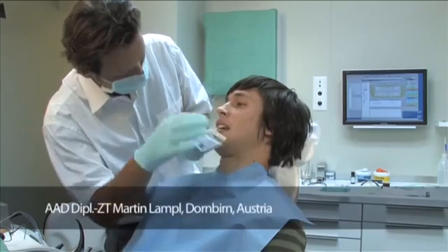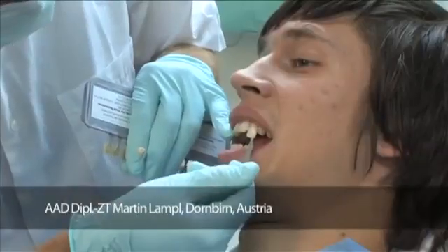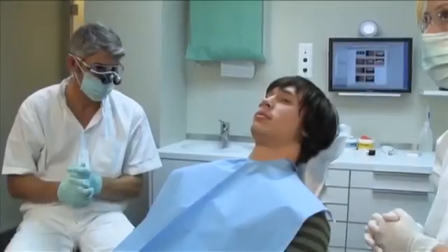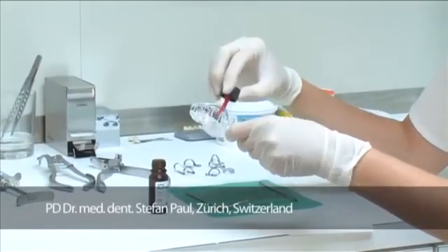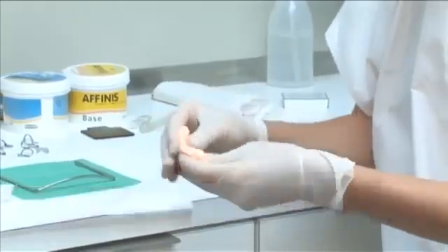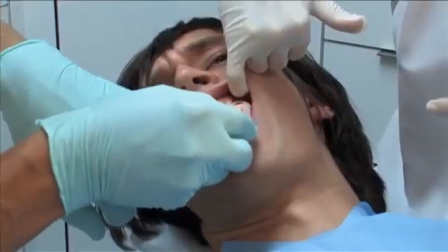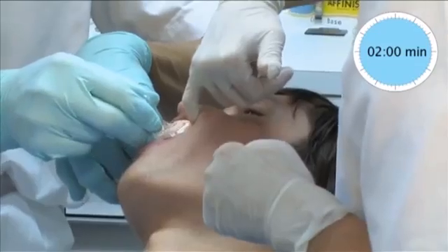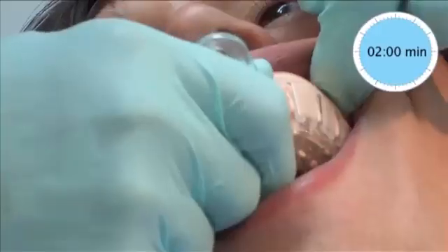The shade selection is performed at the beginning of the case by the dental technician using a standardized shade guide. An impression for the provisional restoration is prepared using an A-silicon putty soft material. Both putty components are kneaded homogeneously together and placed into the single-use impression tray, which was pre-coated with tray adhesive. The impression is then taken.